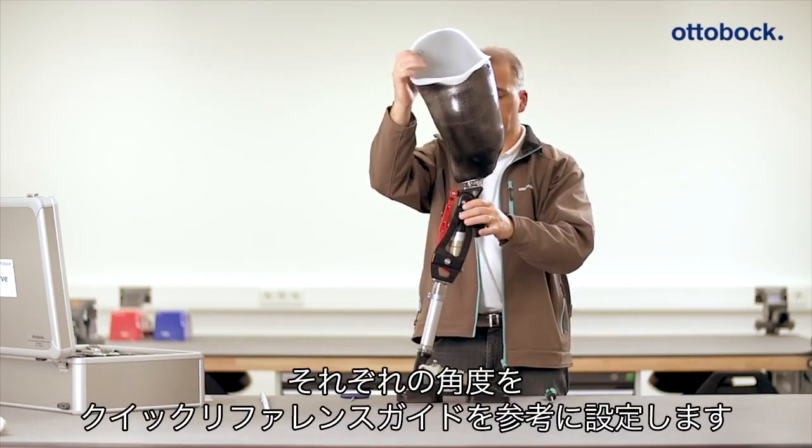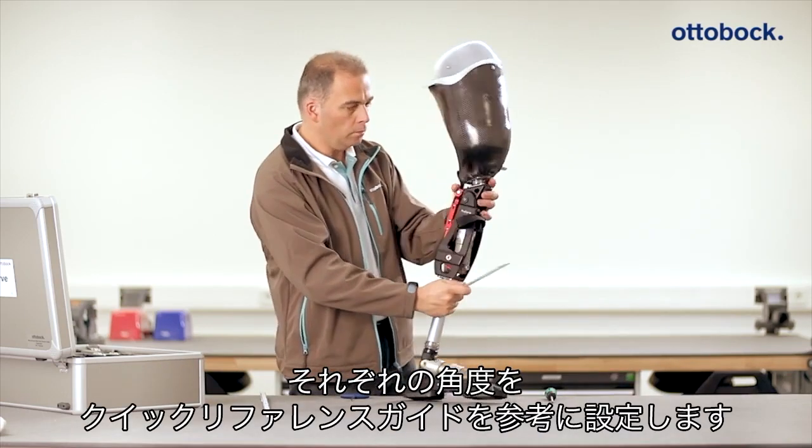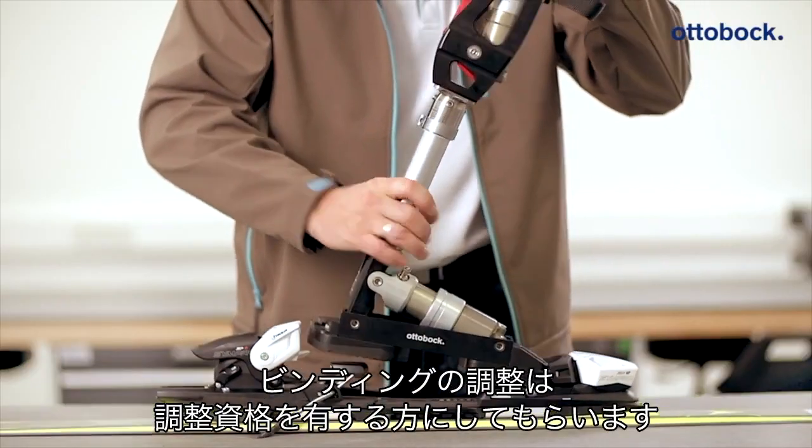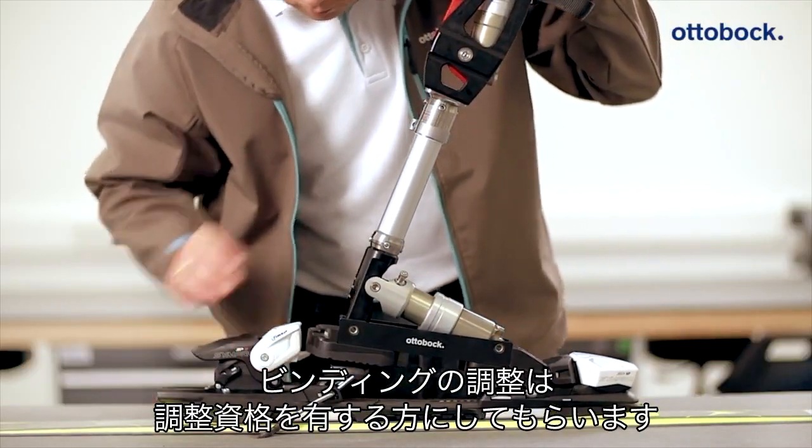Check the flexion position against the table using a goniometer. The ski binding should be adjusted by qualified ski personnel.